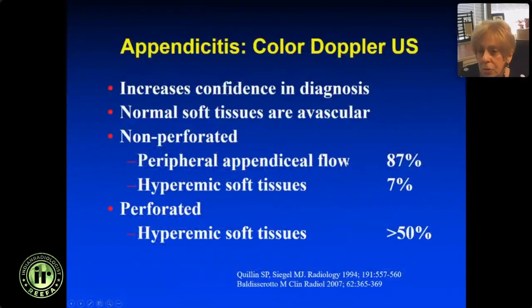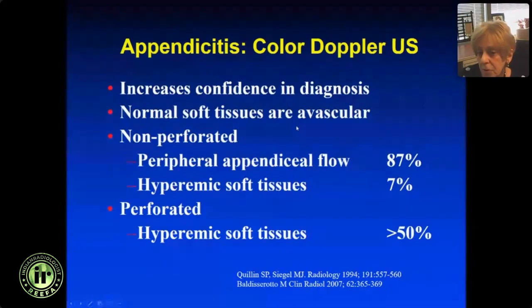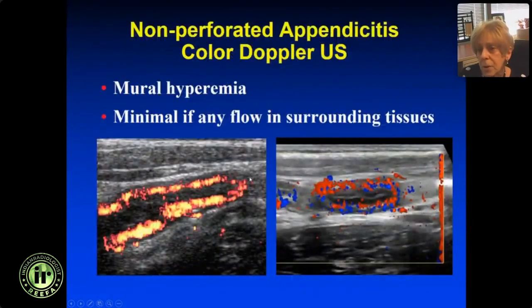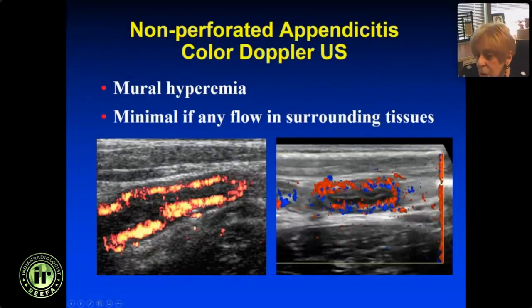Color Doppler can increase your confidence in the diagnosis. Normal soft tissues are avascular. If the appendix is inflamed but not perforated, you'll see flow in the wall and mucosa of the appendix with minimal flow in the soft tissues. If it's perforated, you see a lot more flow in the soft tissues. Here's a non-perforated one — the appendix lights up with hyperemia — and that just increases your confidence in the diagnosis.